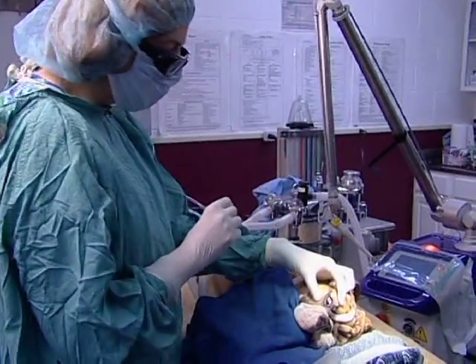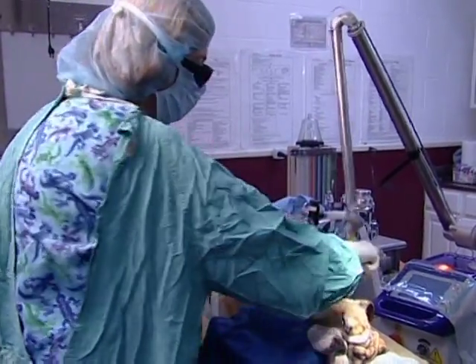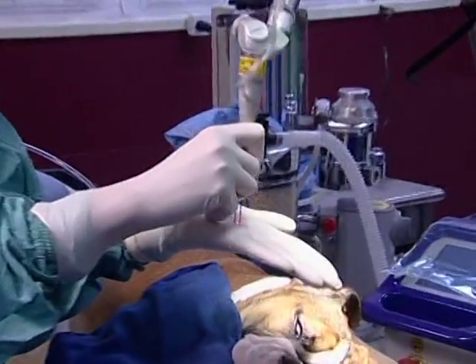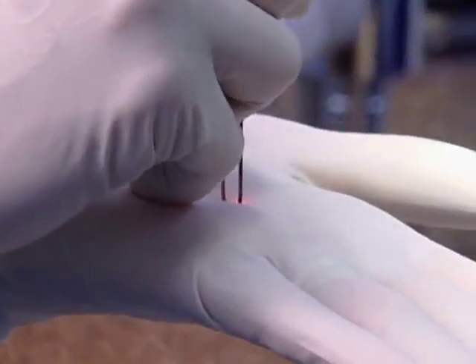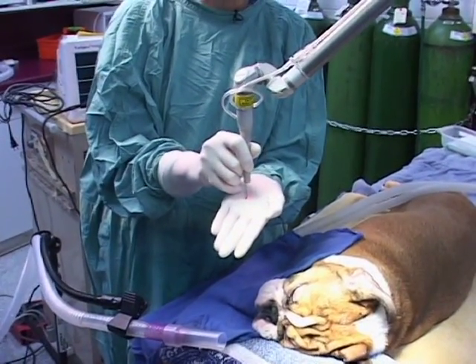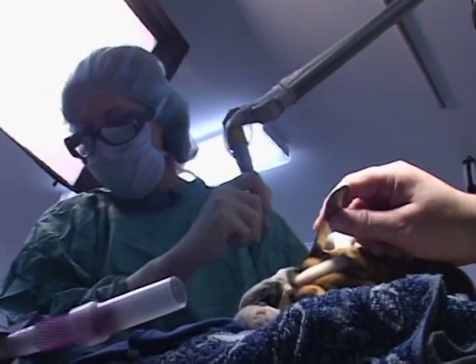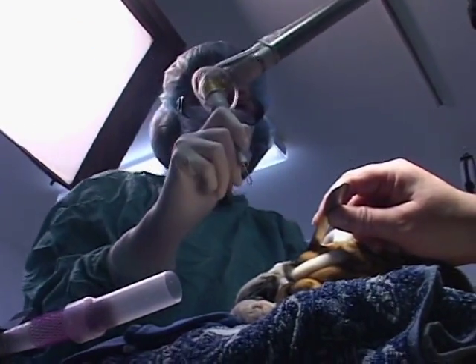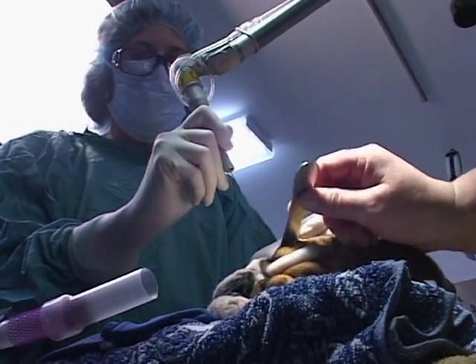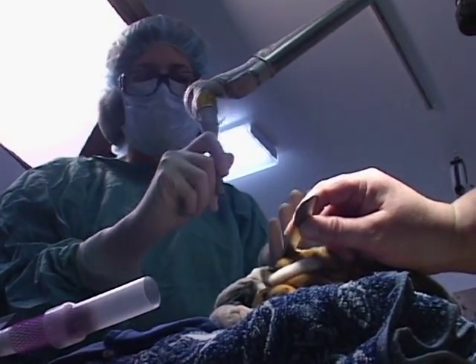There's another way you can use the laser, which is just terrific — you can use it to defocus. What defocus means is the paperclip is your little cheater, your training wheels. It tells you exactly how far away from the tissue to get your optimum beam delivery. Defocus means you're pulling back. With this procedure, what you see is what you get. As we do it, you will see the tissue contracting and the lid actually rolling out.